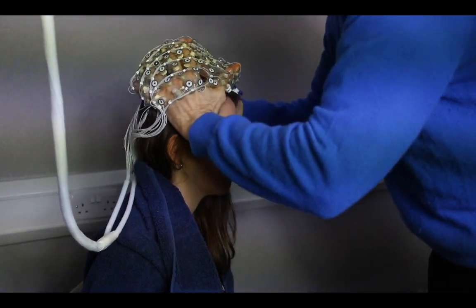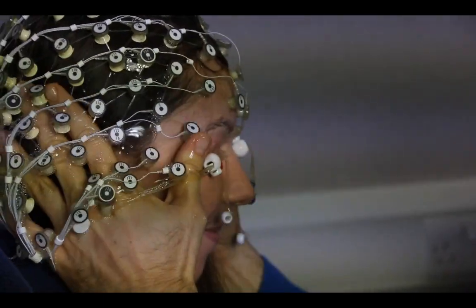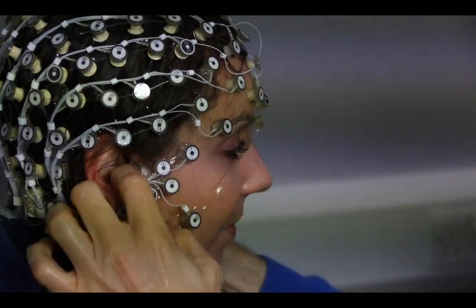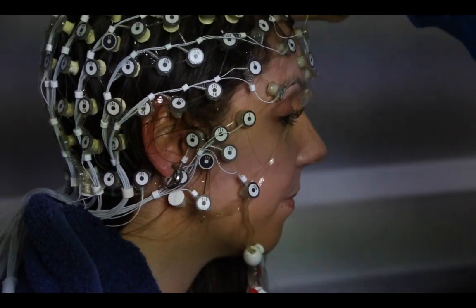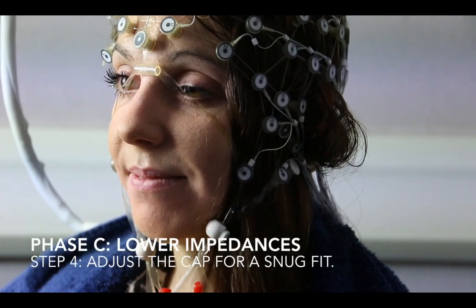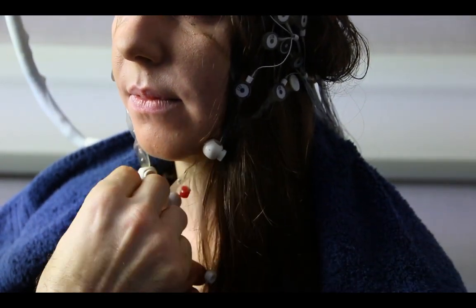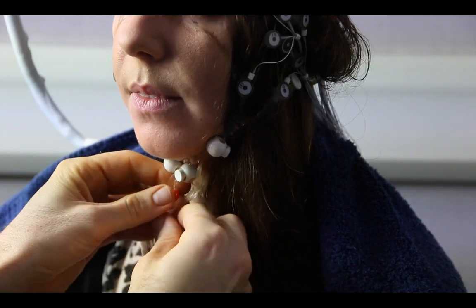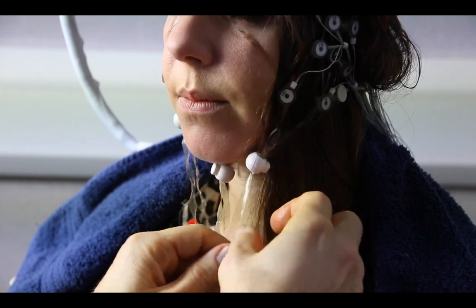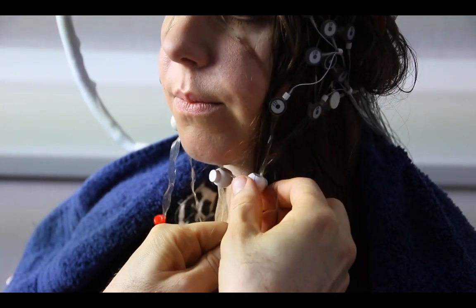As you bring the cap down around the participant's head, bring straps under the chin. There are two holes in the cap which you can adjust underneath the participant's ears. Adjust the cap so it has a very snug yet comfortable fit. It's important that the fit be snug because the more the electrodes press onto the scalp, the easier electricity can be conducted — but of course you also want the participant to be comfortable.